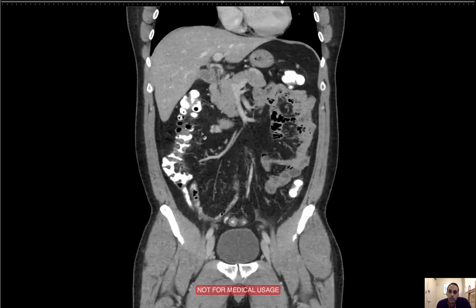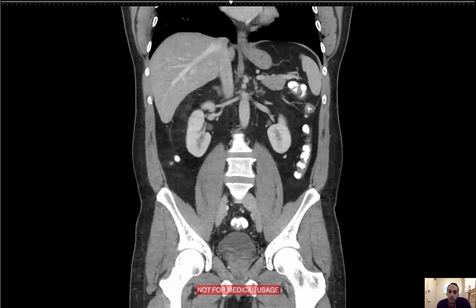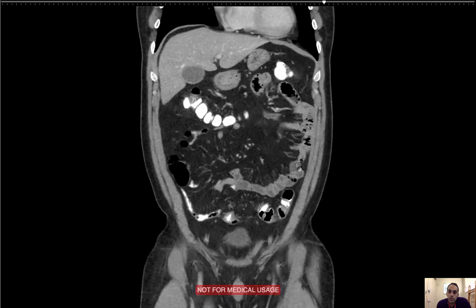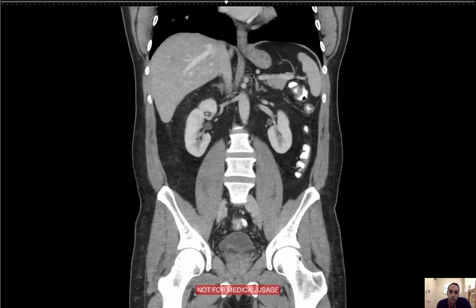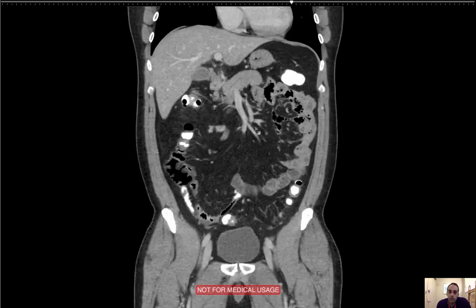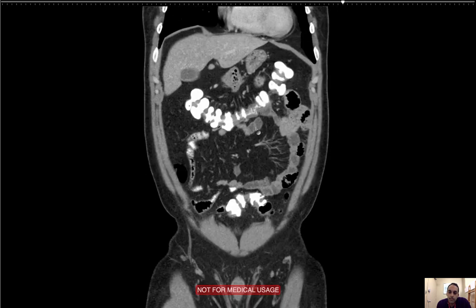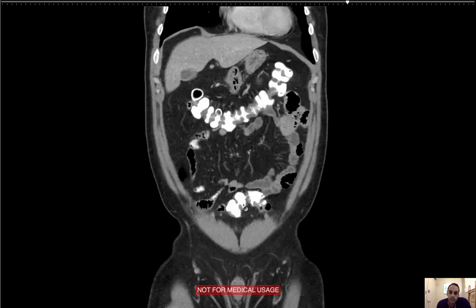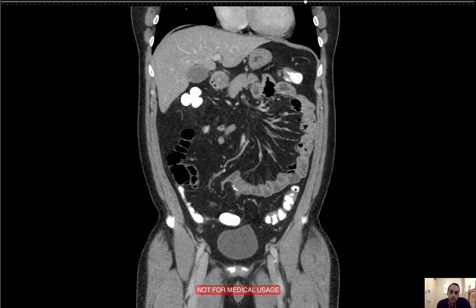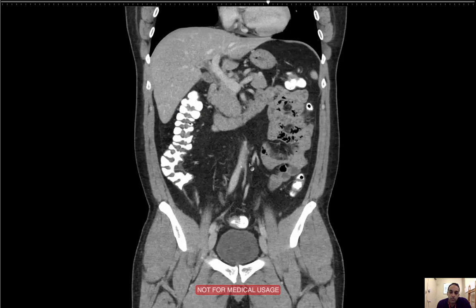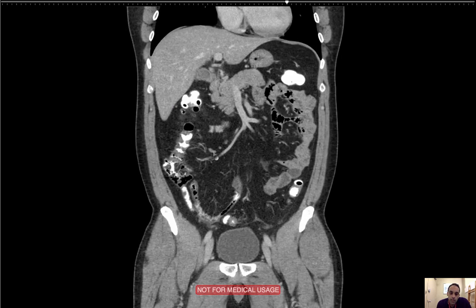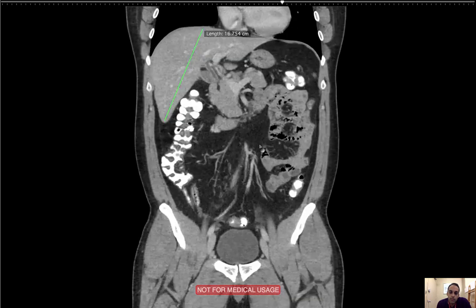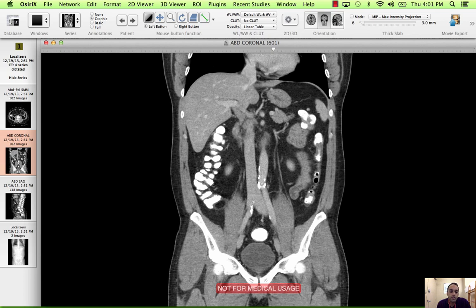Now I'm going to take a look at the small bowel. I like to look at the small bowel in the coronal plane. Focusing on the jejunum first, I'm looking for any wall thickening, any dilatation like a small bowel obstruction, and inflammation of the mesentery — not seeing any of those things. Focusing down now on the ileum, looking for the same things — any thickening of bowel loops, obstructed loops, inflammation in the mesentery, or enlarged nodes. I'm seeing just a couple of regular-sized lymph nodes right along the mesentery. The superior mesenteric vein is visible. Everything looks okay.